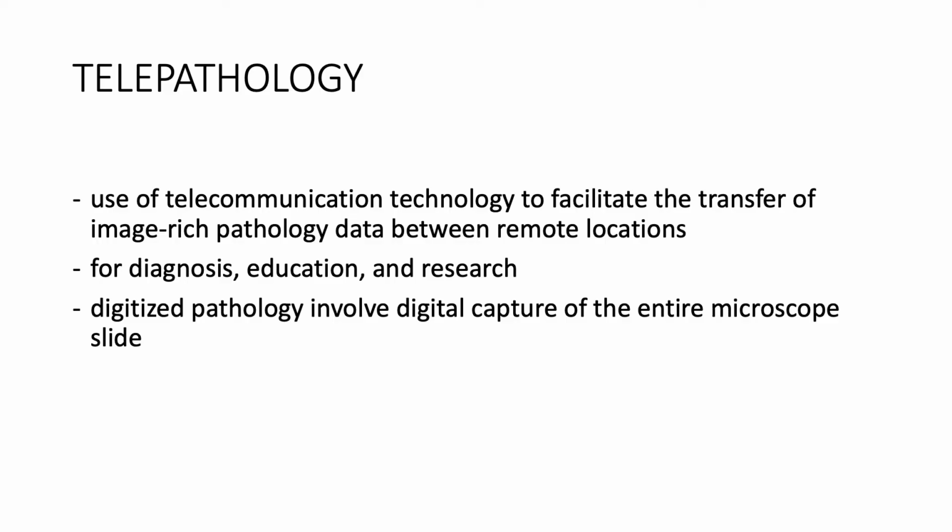So first, what is telepathology? Telepathology is the use of telecommunication technology to transfer image-rich pathology data of digitalized slides between remote locations for diagnosis, education, and research. Digitized pathology slides involve digital capture of the entire microscopic slides.